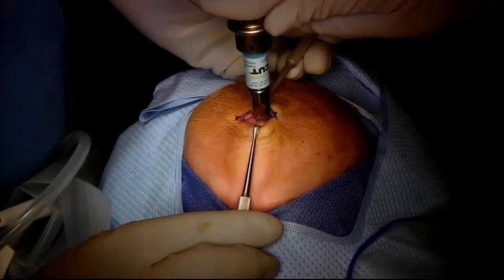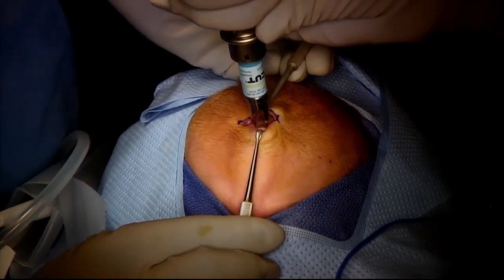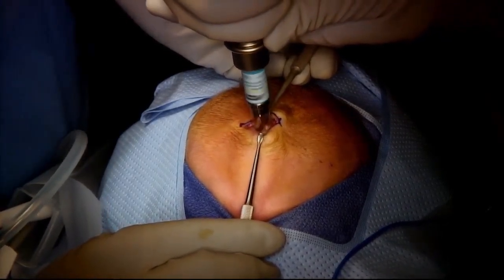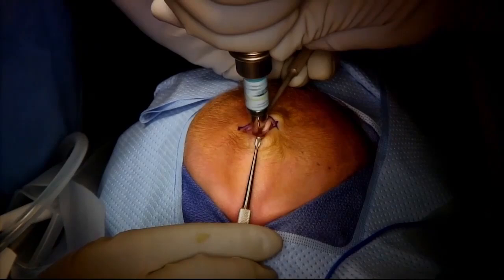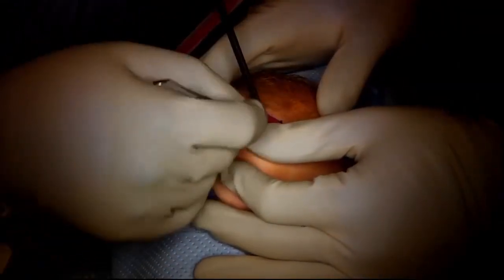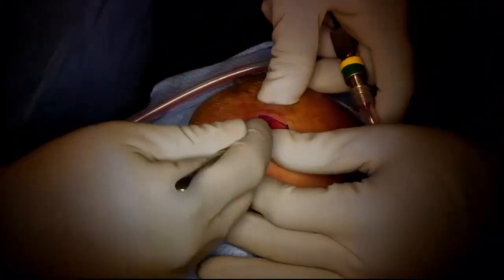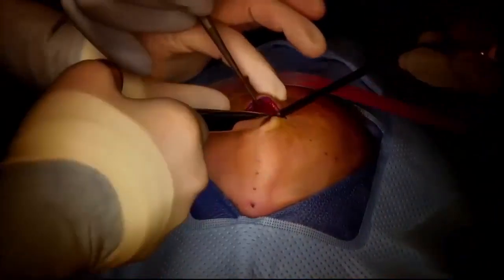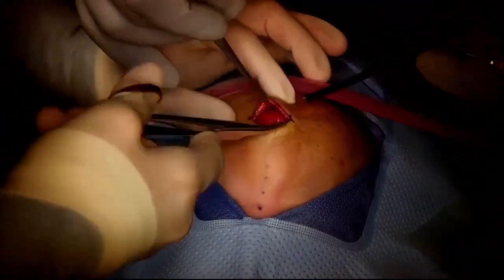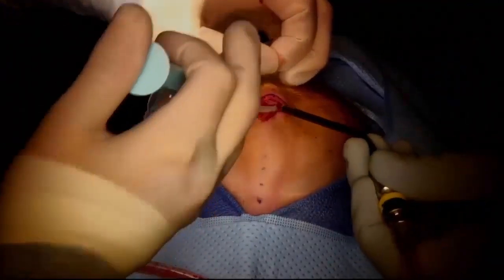A single small burr hole is made at the incision directly over the metopic suture. Once finished, a number 1 Penfield is inserted under the bone and advanced to the fontanelle. A small strip of bone is then cut to reach the fontanelle and release that area. Surgiflo is used for hemostasis.